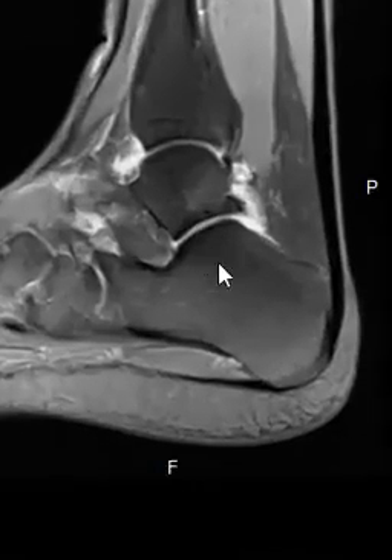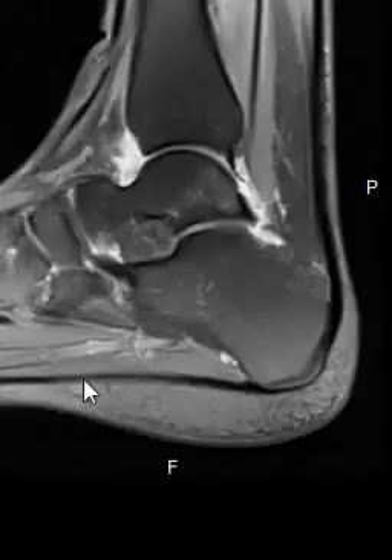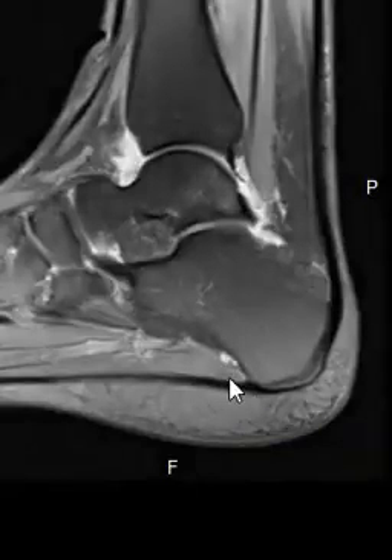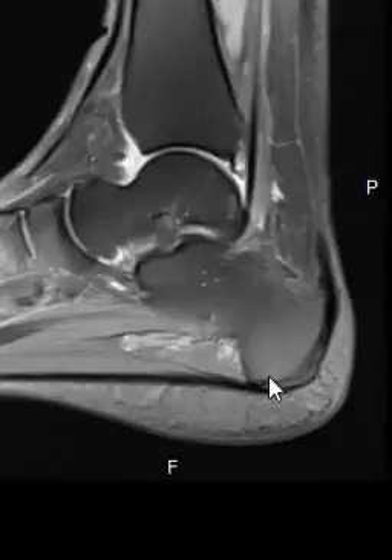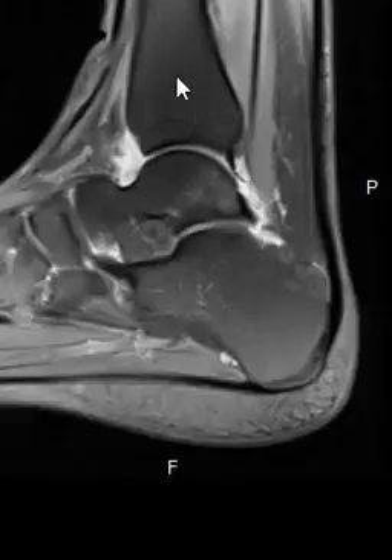Zooming in, it looks beautiful. You see a little fat pad in front — this dark area looks great along the undersurface. We also see a linear band called the plantar fascia. The plantar fascia looks great; sometimes it can be partially torn, thickened, or inflamed, and sometimes you have heel spurs down here. Luckily this one looks very, very good.